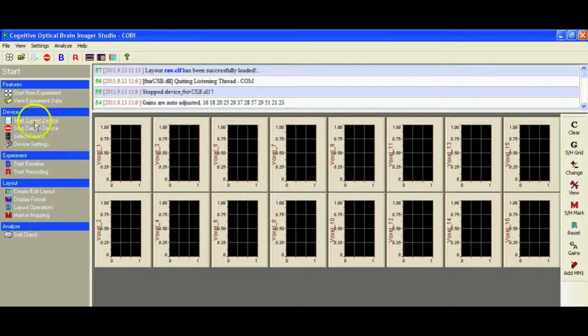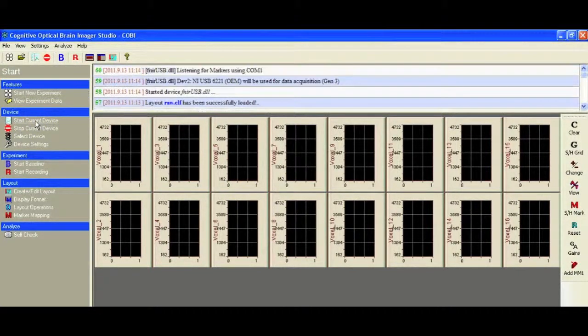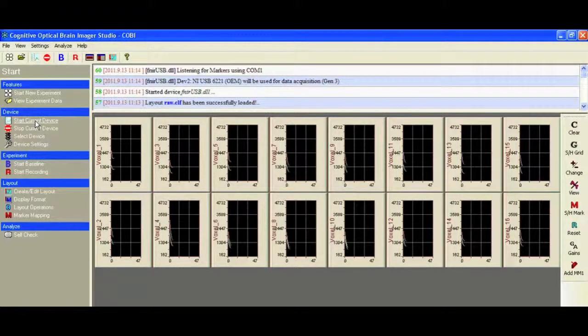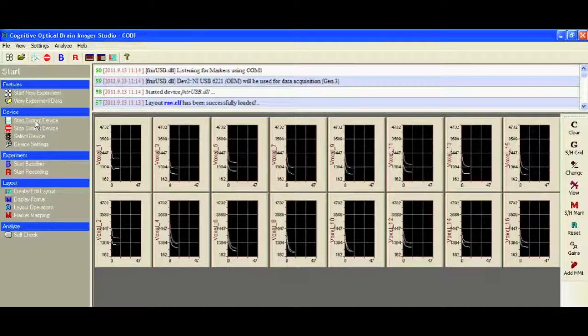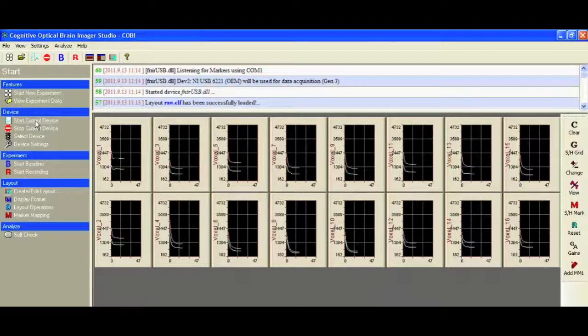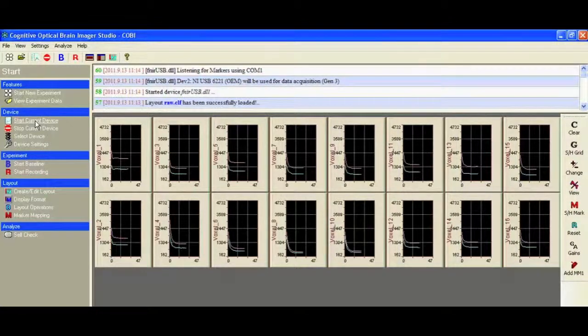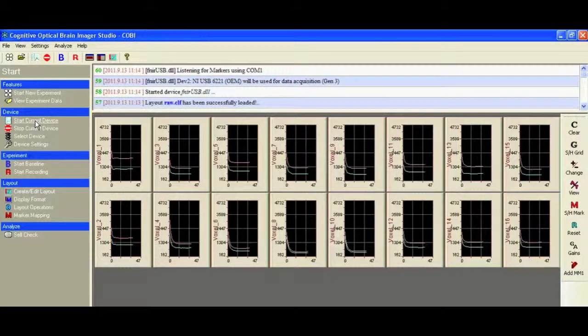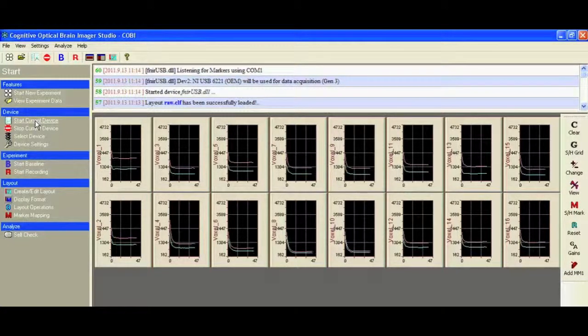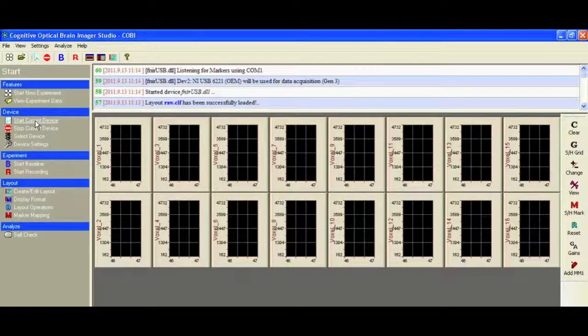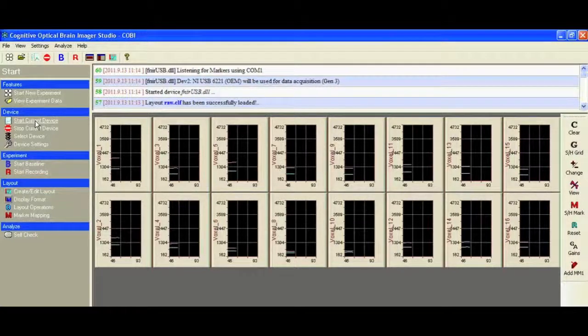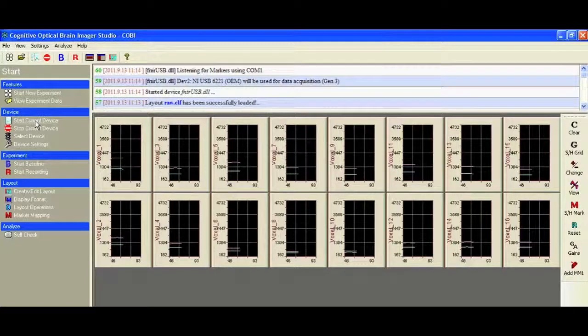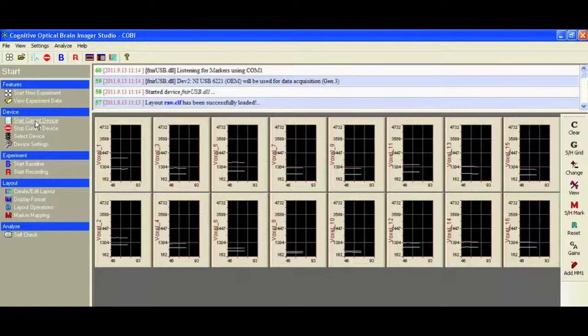That allows us to ensure that we've got everything set up correctly. Now, by starting the device, we should start to see some data. As I said, I've already got the sensor array attached to my subject's forehead, and I'm holding the sensor in place using a Coban wrap. Any kind of bandage will work. It's important that it's comfortable for the subject. You need to make sure that you don't have any hair coming down in front of the sensors, and that the band is securely fastened with no light coming in or breaks in contact.